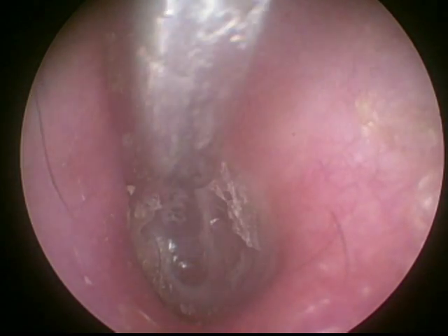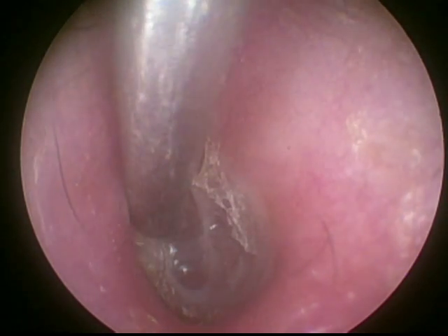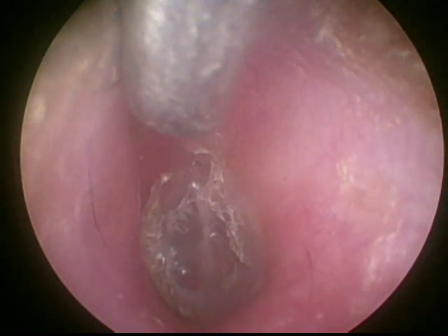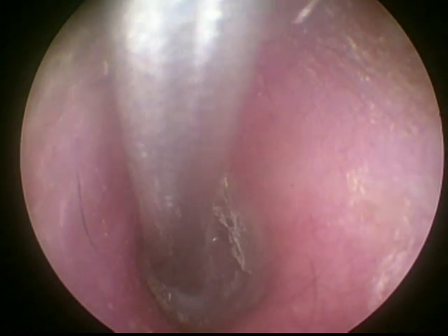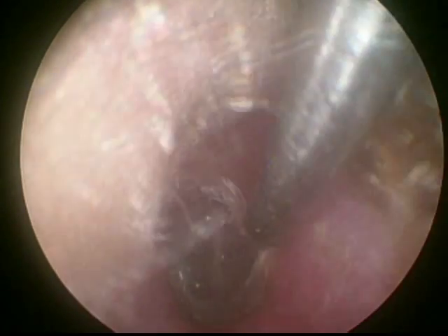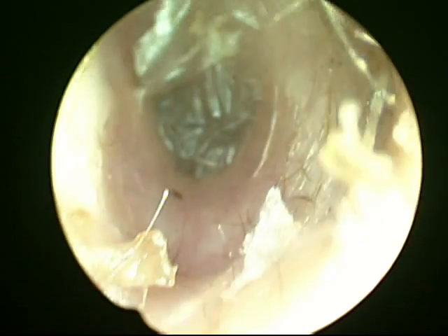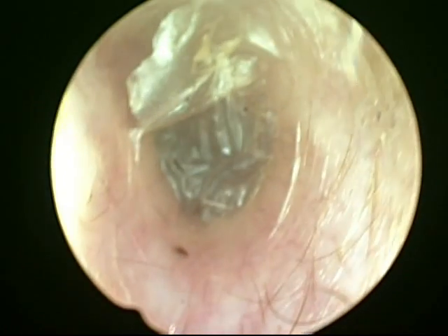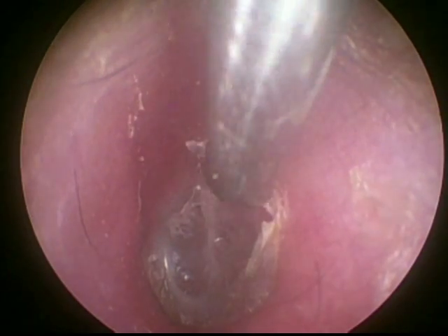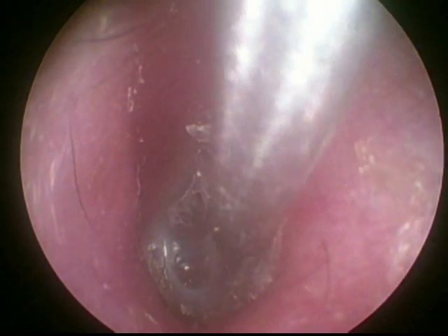In certain cases we can confuse it with the tympanic membrane due to its different look. You can watch this normal tympanic membrane behind this cast, and once you remove it, the conductive hearing loss is gone.